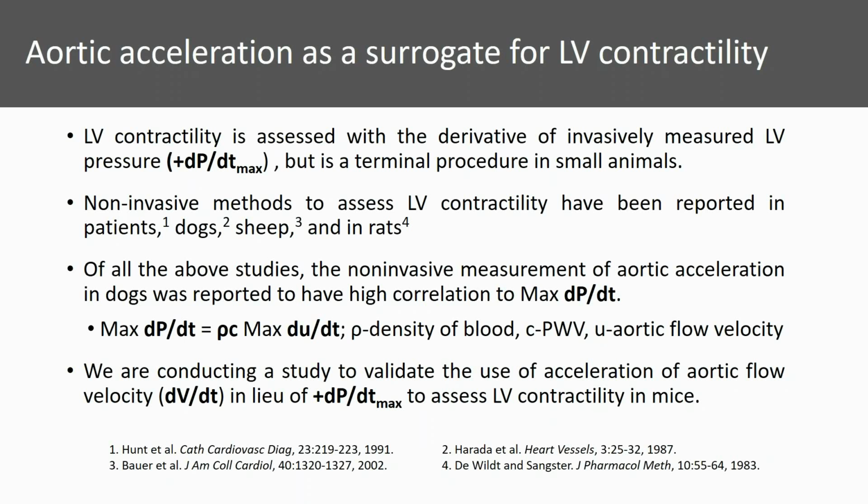Of all these studies we looked at, we found that the one in dogs had a high correlation to maximal dP/dt. The equation was basically max dP/dt is related to maximal dU/dt, where U is nothing but aortic flow velocity. So it was non-invasively measured, and we thought that this would be a good way to validate our measurements for non-invasive determination of LV contractility.